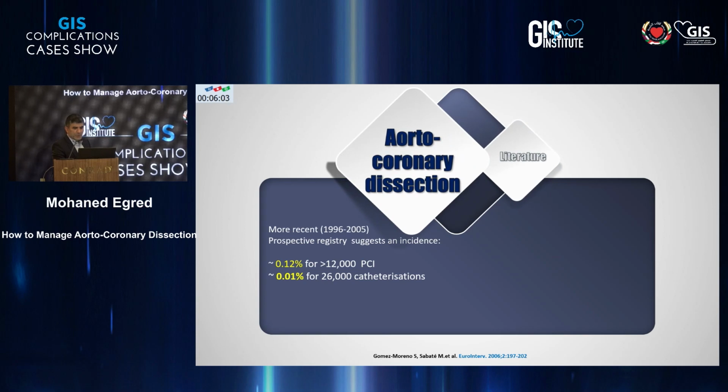Again, they reported another literature review. This is a prospective registry, and they suggested about 0.12% of PCI and less than 0.01% of diagnostic catheterization. So it can still happen, and I think we saw a case yesterday with a diagnostic. So it can still happen with diagnostic, they're not benign. They showed that all were treated by placement of an ostial stent. And this is the main thing for us: how do you treat this?